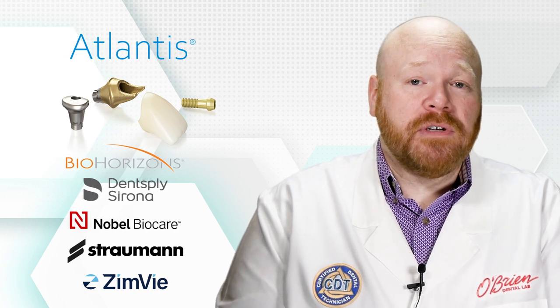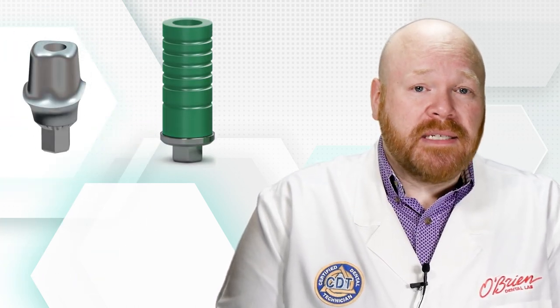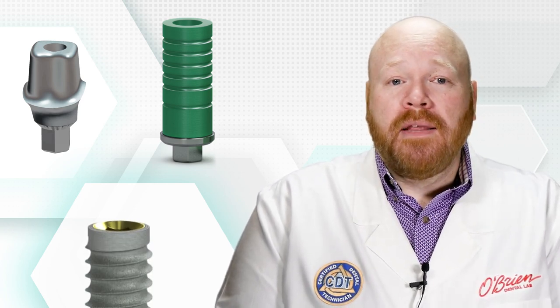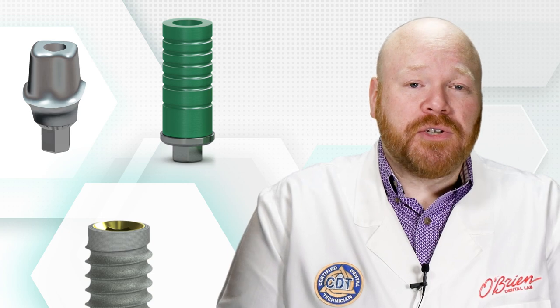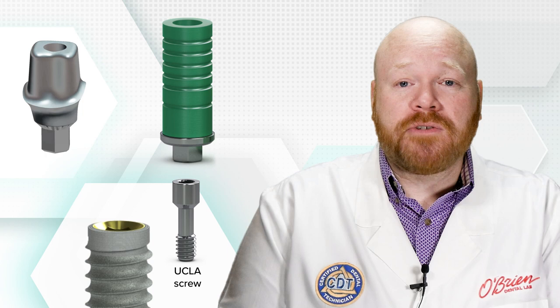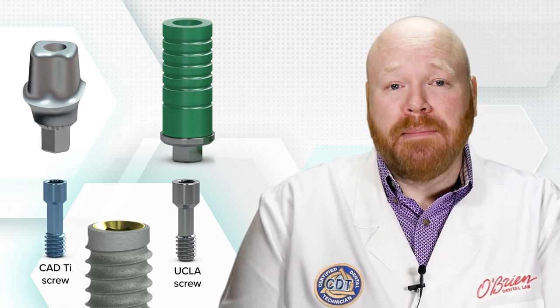But even if an original abutment is used — that is, an abutment made by the same manufacturer as the implant — there can still be multiple variations. For instance, a stock UCLA abutment might have a different screw design than a CAD titanium abutment.